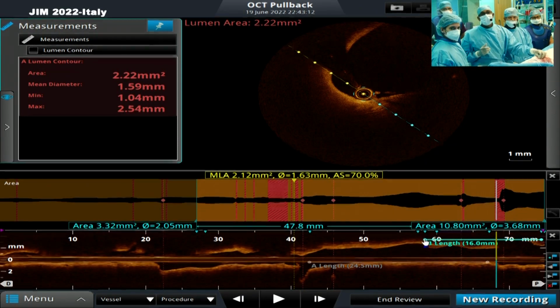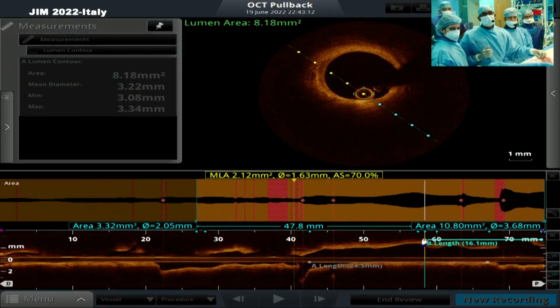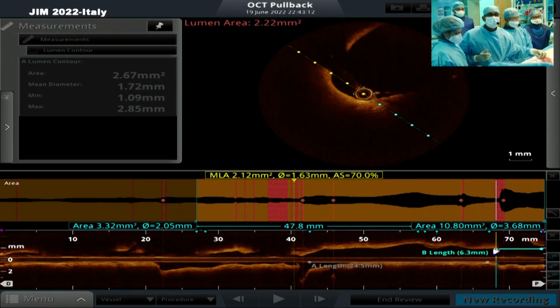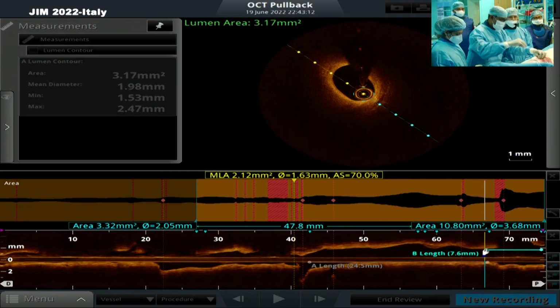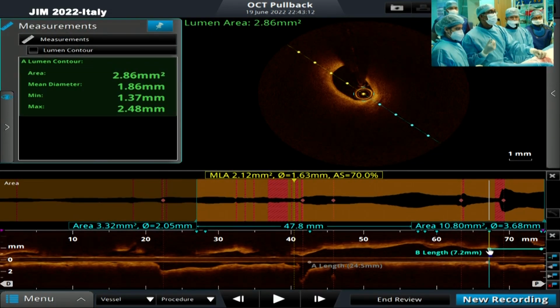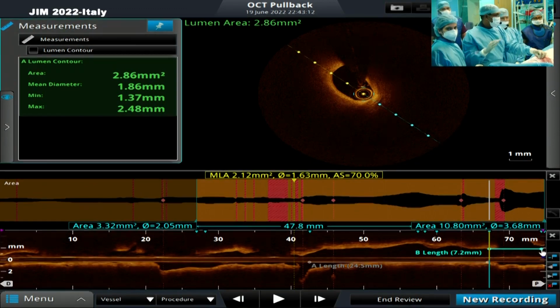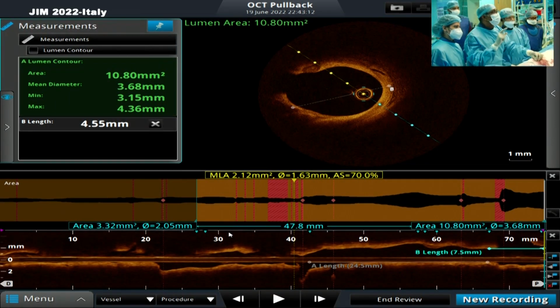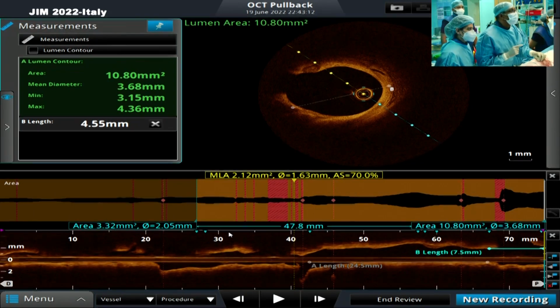Carlo, would you spare the left main? I think Dr. Di Mario would cover the left main, though. Well, the discrepancy is very important, and of course you never like to go from 4.5 to a relatively smaller overlap in the LAD.